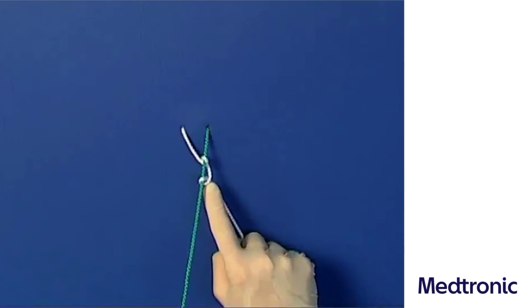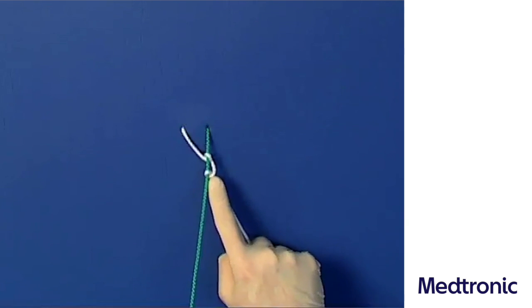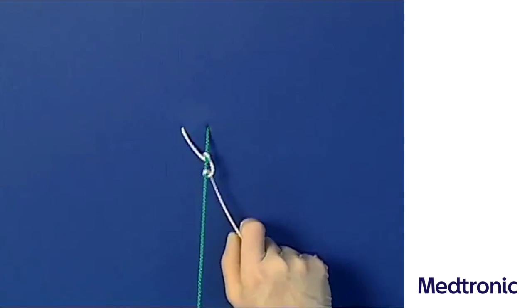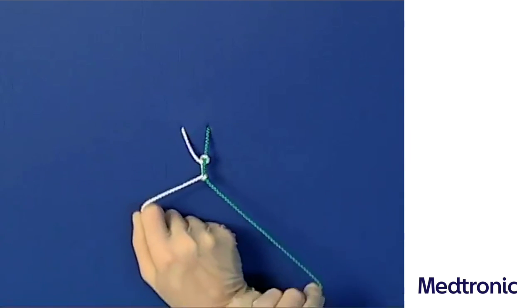Only if the left thread is consistently used as the pulling thread can the formed loops be placed with the index finger. If the pulling force is applied to the tying thread, however, the knot is pulled tight immediately, before achieving its aim.